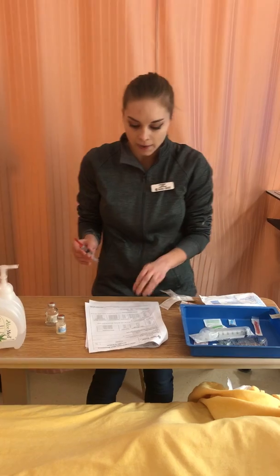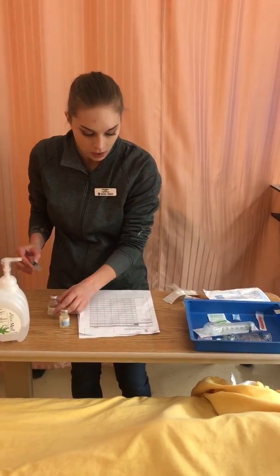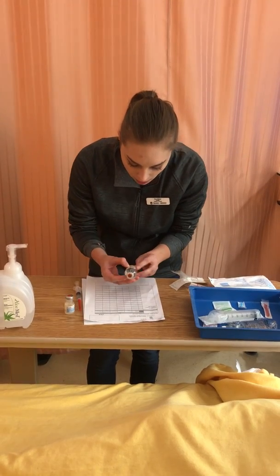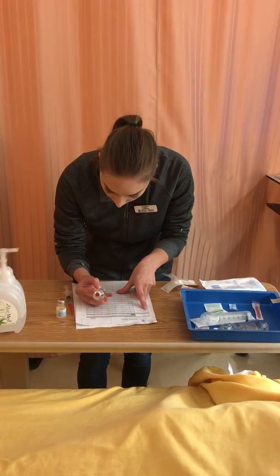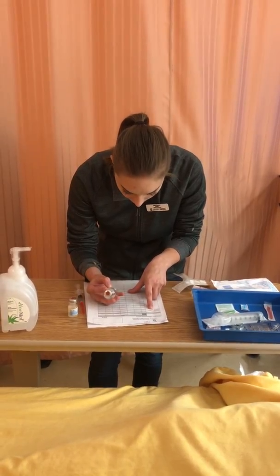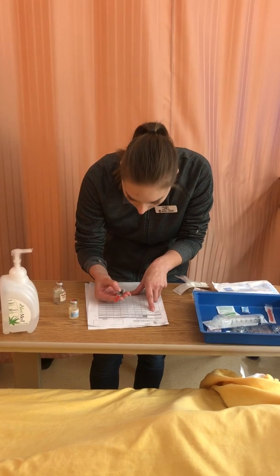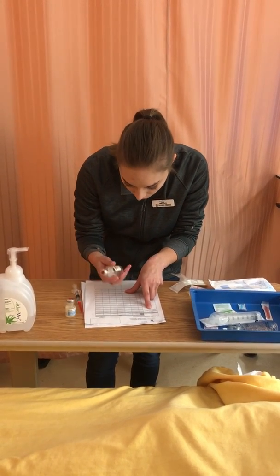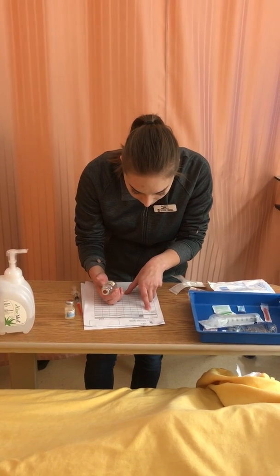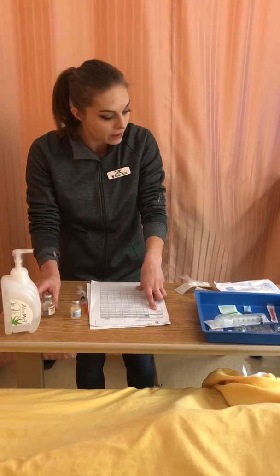I'm going to do my second med check before I dilute it. So comparing it again to the MAR, it's for my patient John Smith. It's penicillin G. It's for IV, which I have. I'm going for 3 million units. I'm going to have 3 mL, which is what I have in my syringe. And it's given every 6 hours, due at 8, and it's quarter to 2, so I'm able to give it.